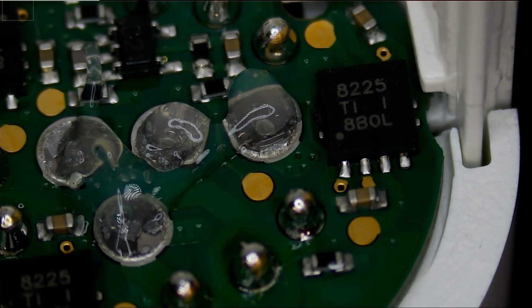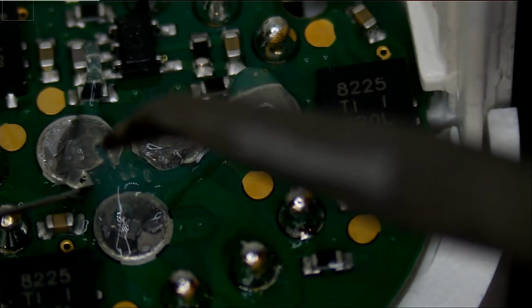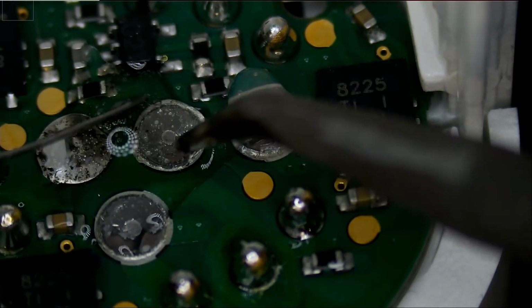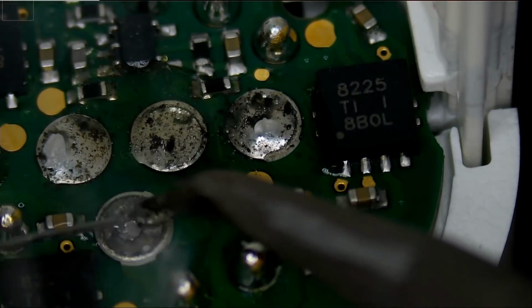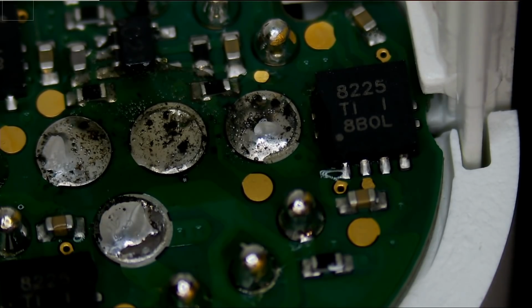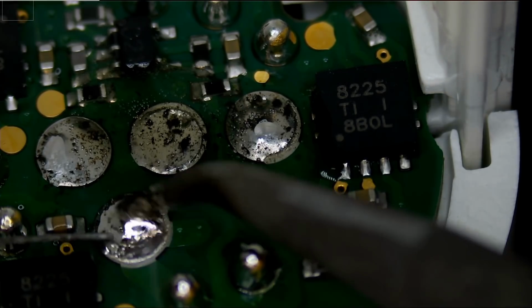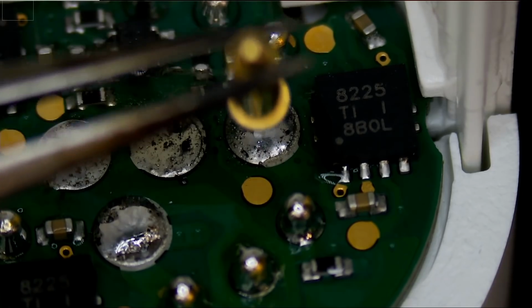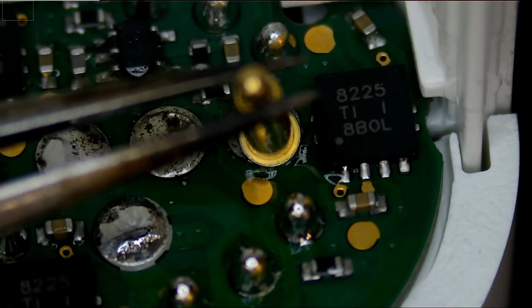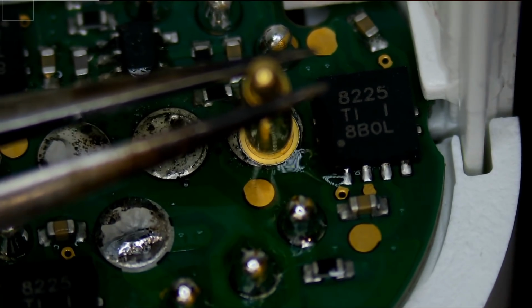I cannot rest my wrist on the bench because the tool is a bit high. And right now, if it wasn't for the bent tip, it would be hard to position the tip vertically to apply solder. So a bent tip is most definitely needed in this scenario. Let's grab that pin and attempt to solder the first one. Once we get the hang of how to solder the first one, then the rest should follow. Should be easy.